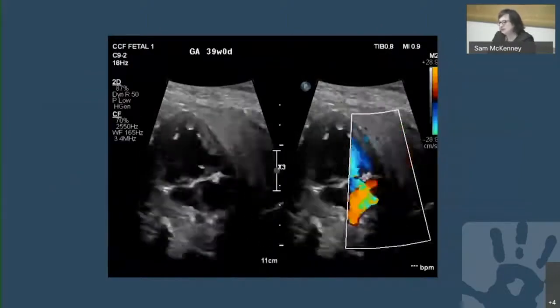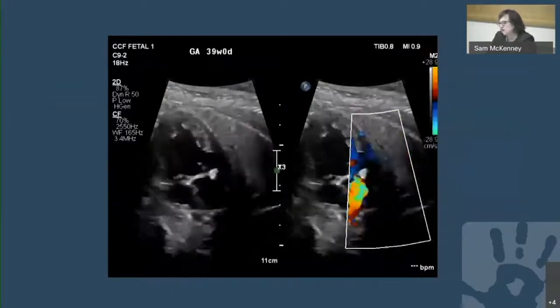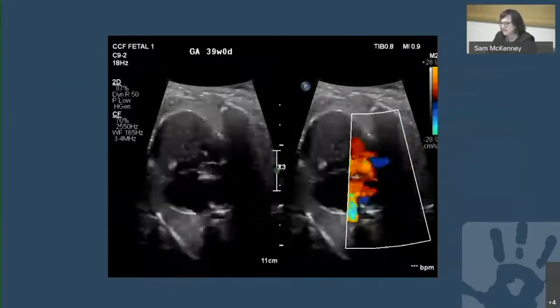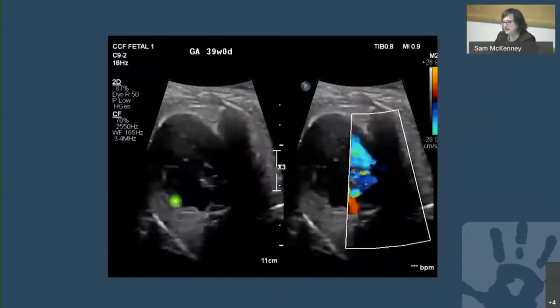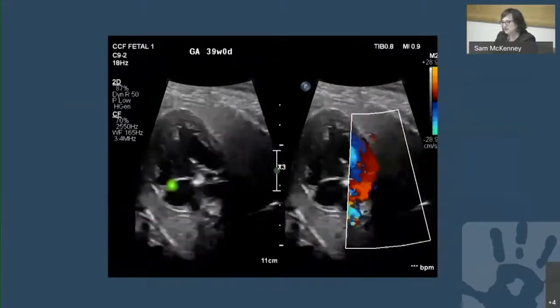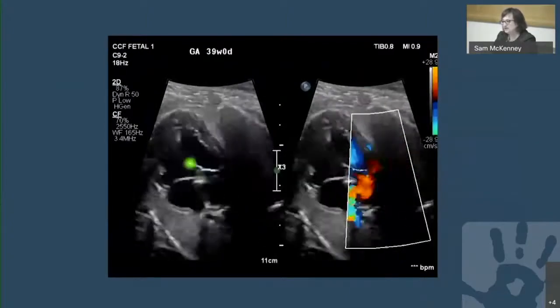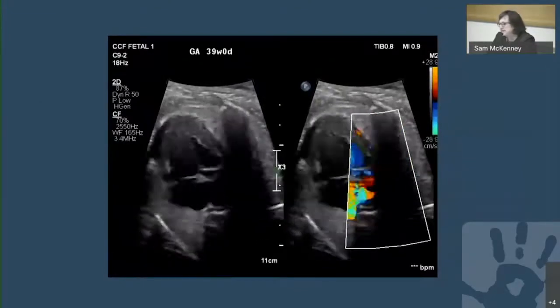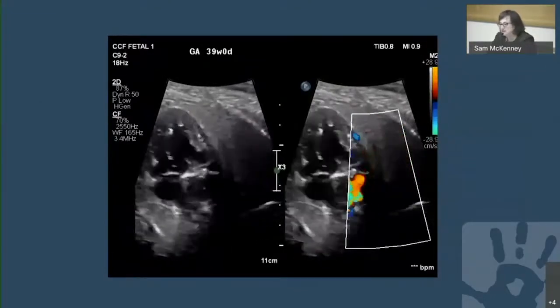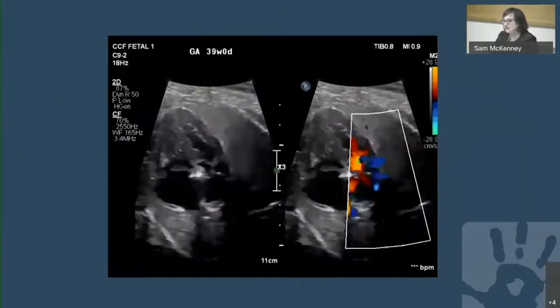This is a slightly more complex form of a single ventricle heart, what we call double inlet single left ventricle. This one you could see has two fairly normal looking AV valves, or mitral and tricuspid valve, but there's actually one single ventricle that they both empty into with no ventricular septum at all. And this one you can see would be much easier to miss on your screening ultrasounds, and that's actually why this fetus did not present till about 39 weeks.